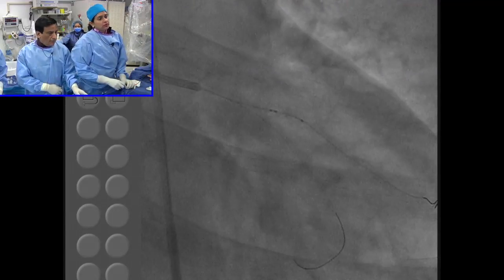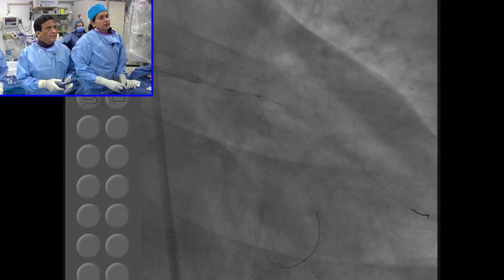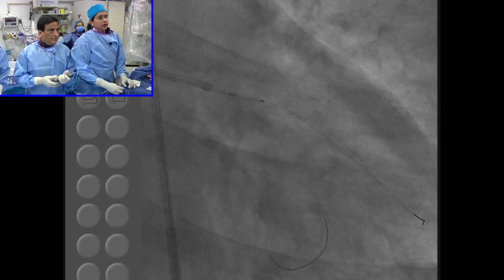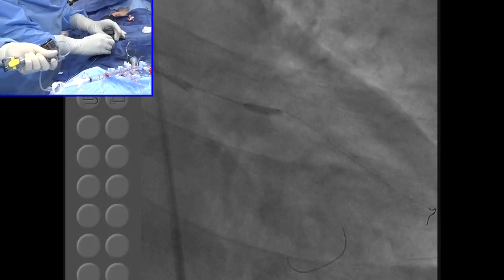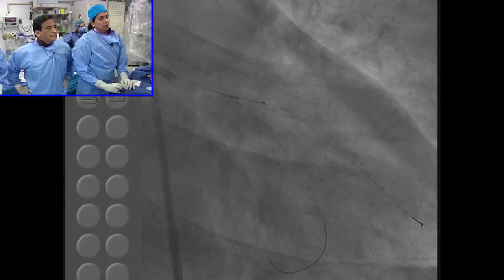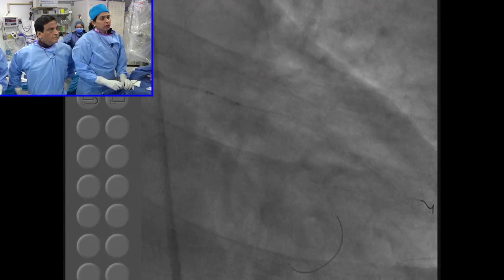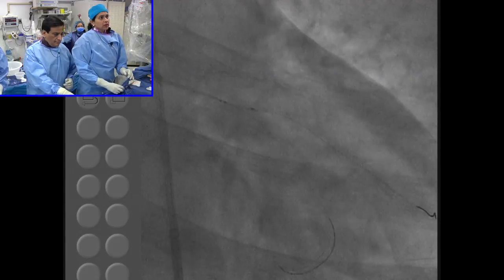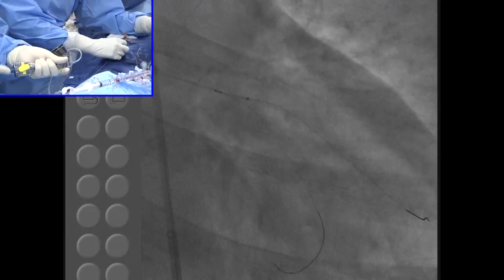This one is a 2.25. The same balloon, 12. Not that. Same balloon that I'll use. I'm not talking about that stent. Yeah, 2.5. 2.5 12, and a 2.5 38. Yeah, or 2.75 38. No, so 2.5 is okay. If you put a 2.75, it will be okay, but no, I think it'll plump a lot. Go up here. We just want to make sure that ostium is well expanded.